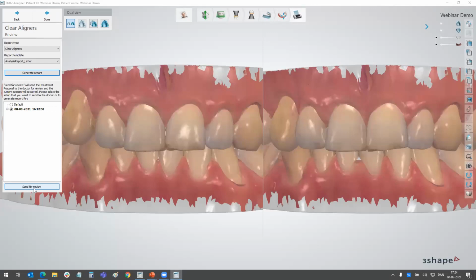When will the pricing be available so we can let our customers know about the new upgrade fee? I hope you received the new price list from our sales and country managers you're working with, because the new pricing is already done and has been shared. It will go live on September 15th, when we also do the commercial launch. So I would suggest from that day on. And if for some reason you don't have the price list yet, I would suggest you reach out to the country manager you work with.